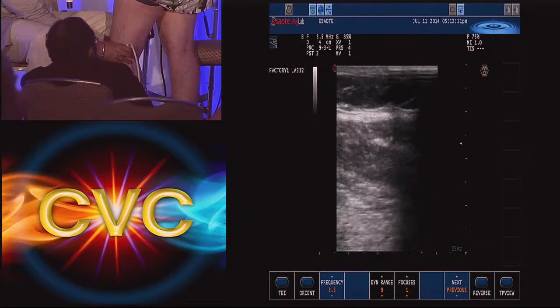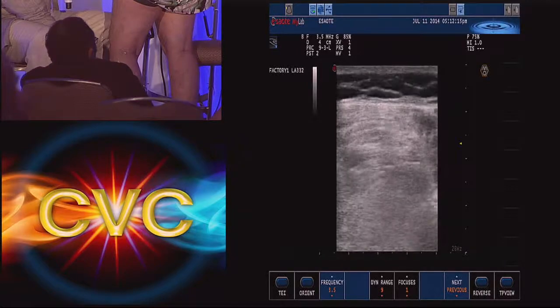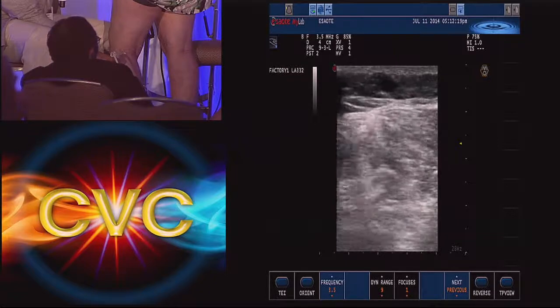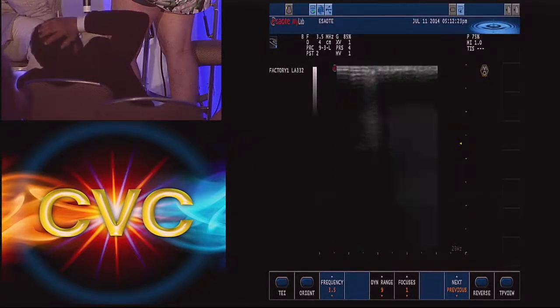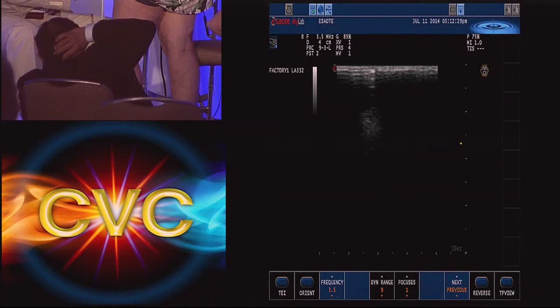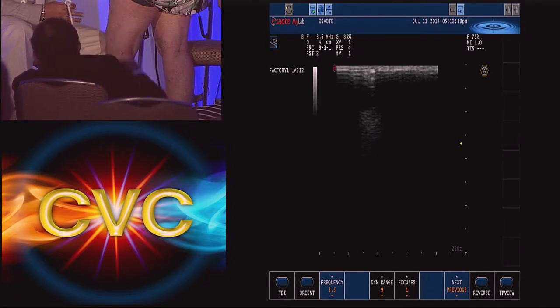So I didn't find a perforator here. And if I did, I would leave it alone. Once it's done, repeat the ultrasound and see if something's still filling it. But the pressure from the saphenous is reflecting all the way down here. And once I ablate this, if this is the only source of incompetence, this will all settle down. And then she would be a good candidate for phlebectomy or whatever else. But I wouldn't do it the very first time.